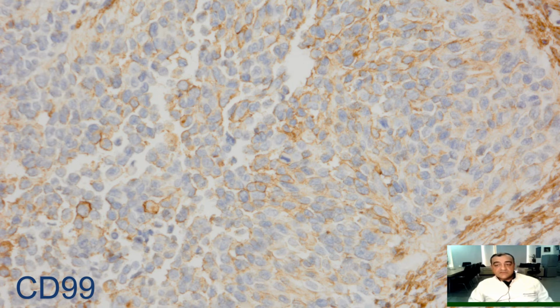In some cases of rhabdomyosarcoma, we can see moderate membranous staining, although it must also be noted that in rhabdomyosarcoma, we have some cytoplasmic accentuation of the staining with this marker.